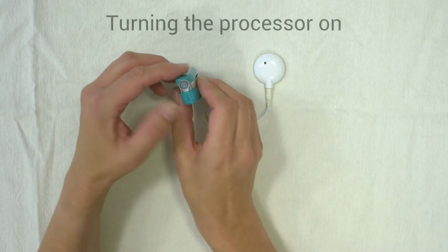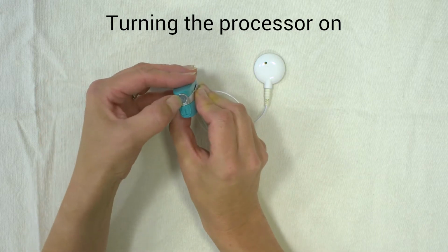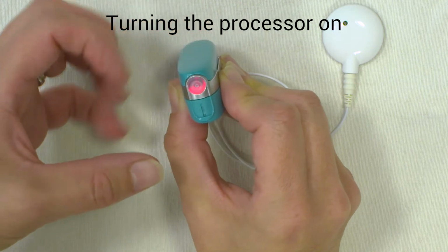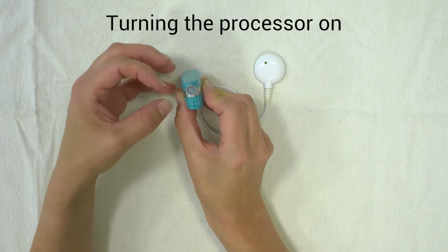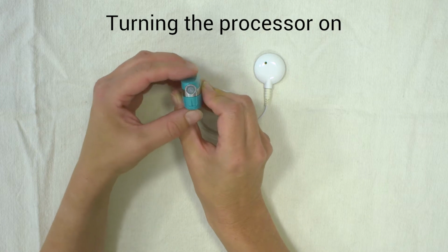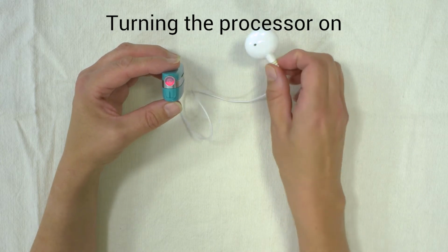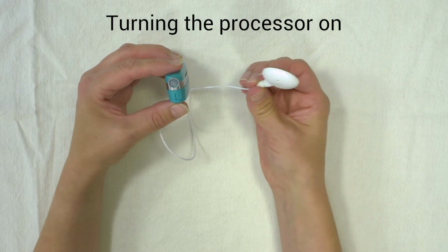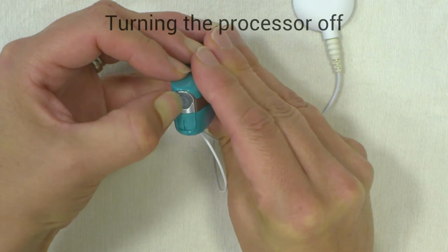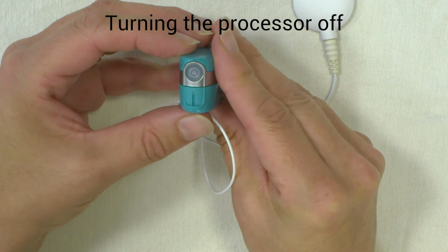In order to turn the processor on and off, you press and hold the button at one end of the processor. If I press and hold it now, you saw a flashing orange light which denotes how well the battery is charged. Then you get a green light, and the number of green flashes denotes which program you're on. The red light indicates there's a problem, and at the moment there's a problem because we're not connected to the patient's implant. So once you connect the coil onto the patient's implant, the red flashing light should disappear. To turn it off, hold the button down again, and the orange light disappears and the processor's turned off.